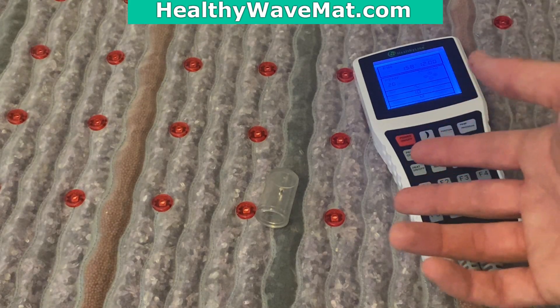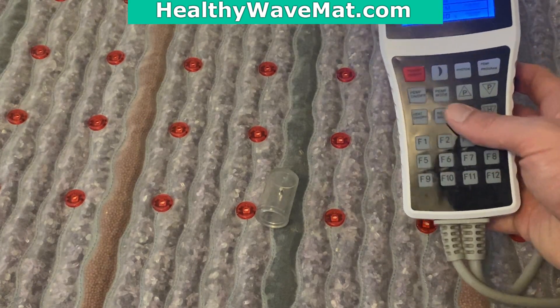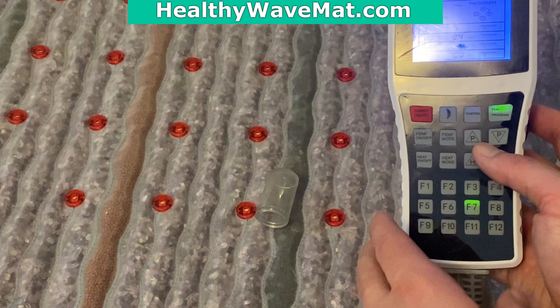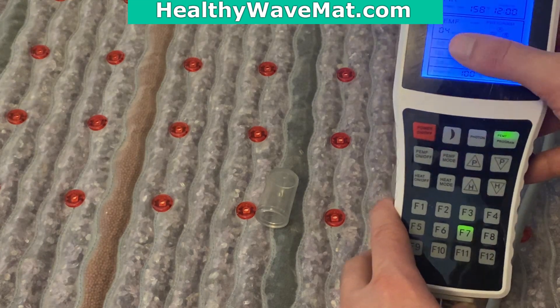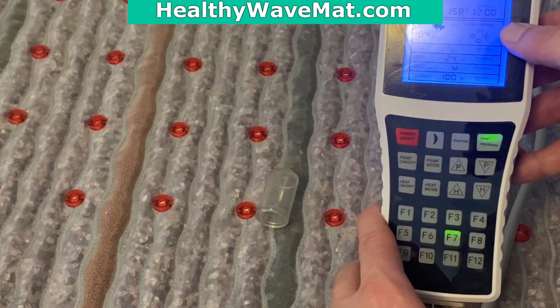Another way to see if the PMF is working is just by looking at the program on the controller itself. Let's bring up the controller — we'll start program seven, which is the best for checking visually. All you need to look at is whether you're seeing the arrow moving on this four-step program. If you're seeing the timer go down and the four-step program moving, your PMF is working.